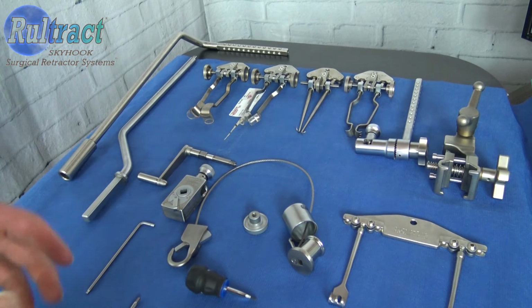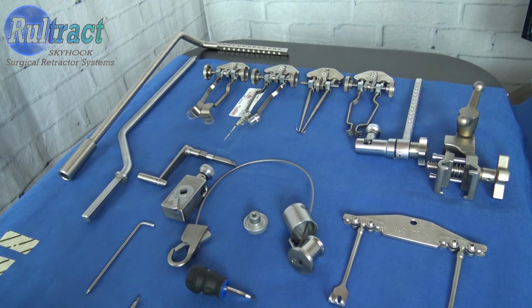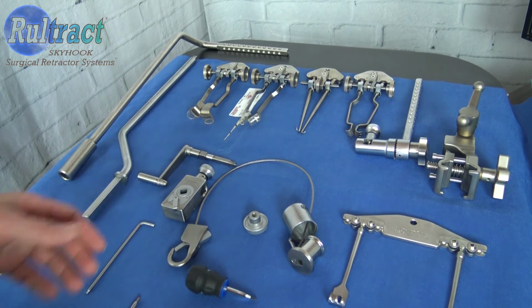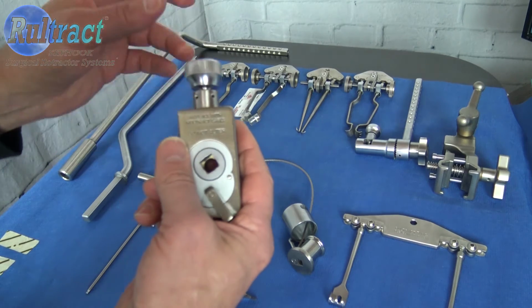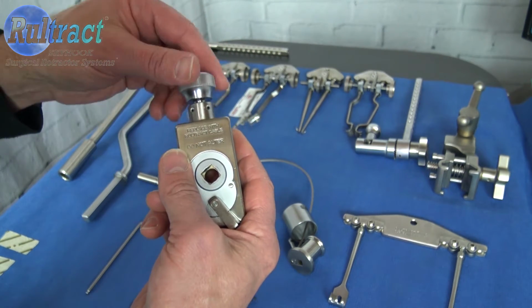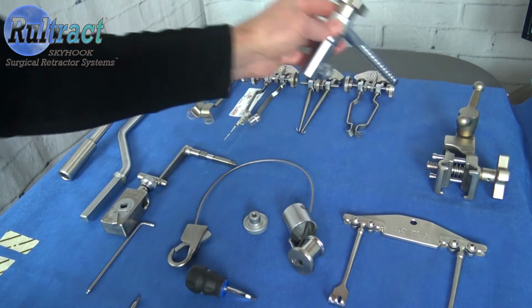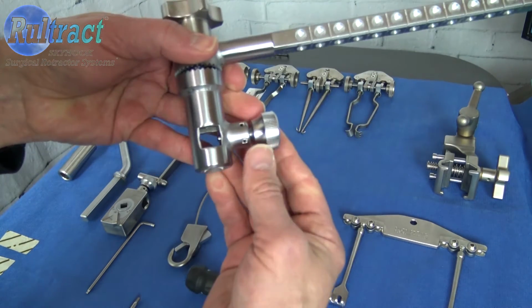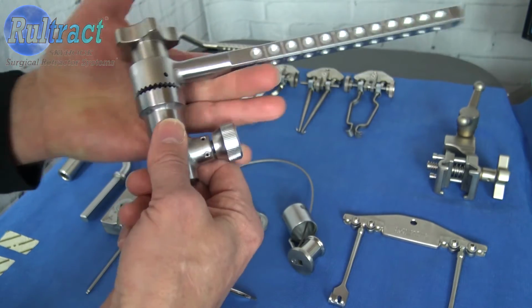After you have checked for tightness in all of the screws and fasteners, we are going to check positions of the knobs. So prior to sterilization, make sure that this lock knob is not closed all the way or opened all the way. You want it somewhere in the middle. Same thing with the lock knob on the rotating extender bar. Make sure that it's somewhere in the middle, not opened or closed all the way.